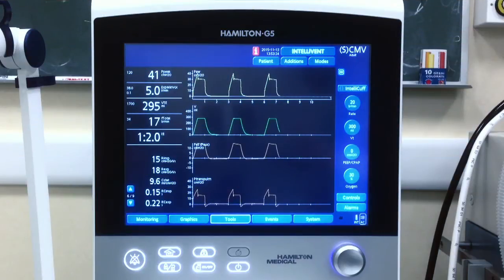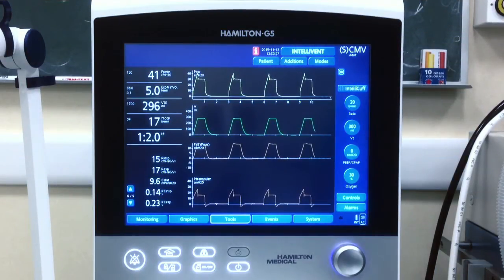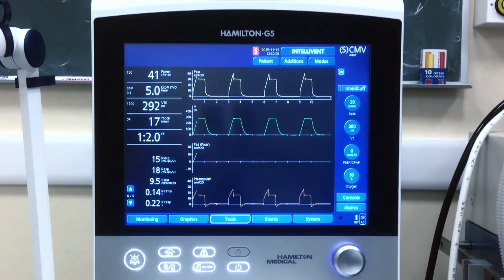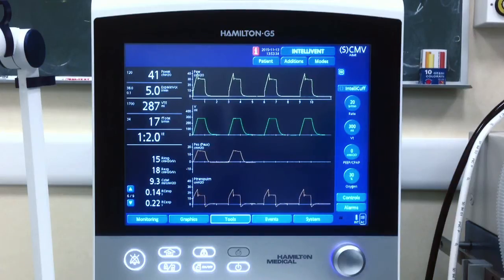This is how we can measure the partition compliance of the lung and chest wall with the help of esophageal pressure on a Hamilton ventilator. This is particularly useful to exclude low compliance of the chest wall when it's hard to ventilate the patient.